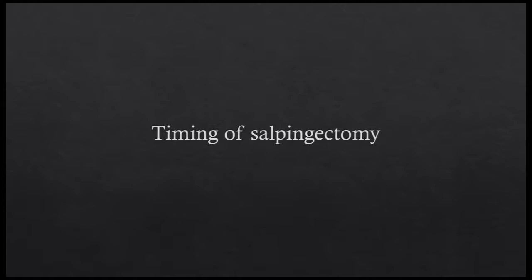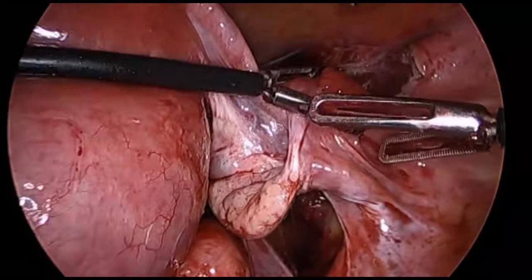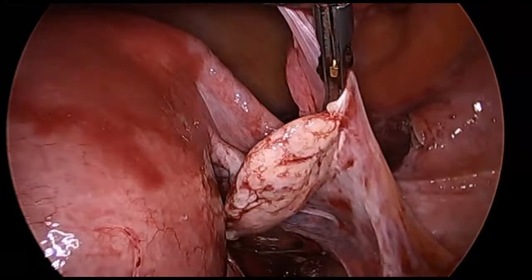A salpingectomy can be performed either before or after securing the uterine blood supply. Performing the salpingectomy prior to control of the uterine blood supply is ideal when the uterus is small because the fallopian tubes are not placed on excessive tension. This technique also works well when the fallopian tubes are not affected with significant adhesive disease, and generally does not require the use of a surgical assistant.